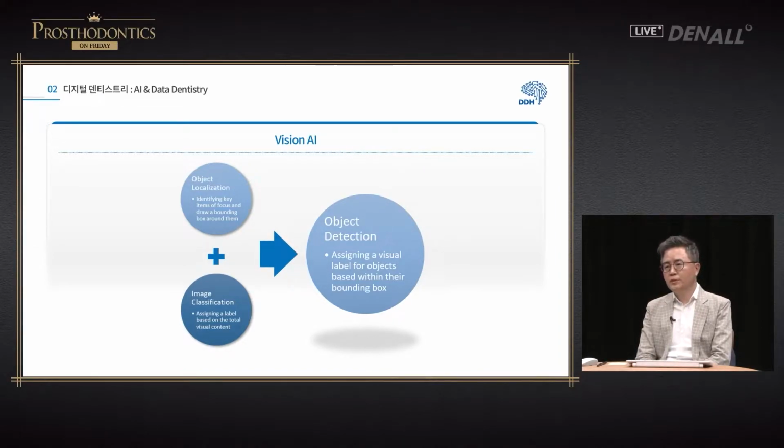If our field of interest when we look at panoramic image is tooth or alveolar bone, we label it. If we pre-process it and learn it, then classification is formed. Our object of interest is detected and localized at the same time. If we want to separate a separate tooth, we need to do segmentation. This is applied the same in 2D, 3D images and scan data.